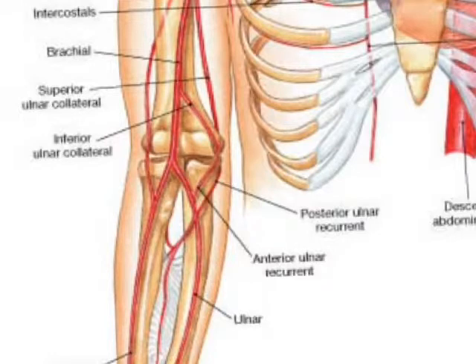I felt terrible. But the point here is that these access points that we like are generally the antecubital vein on the right side. Right?